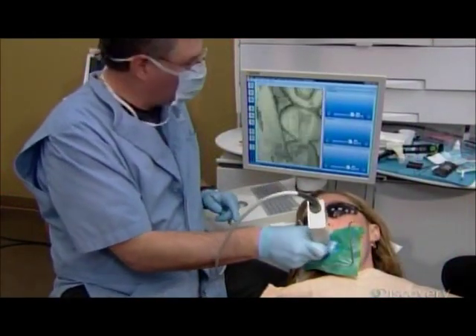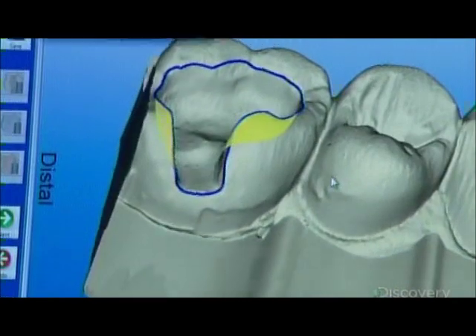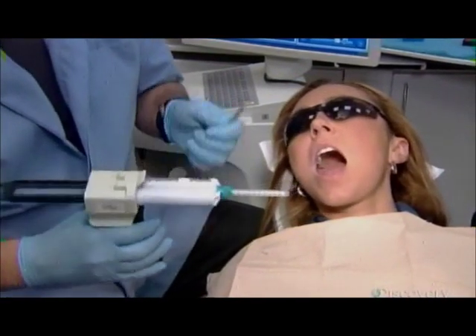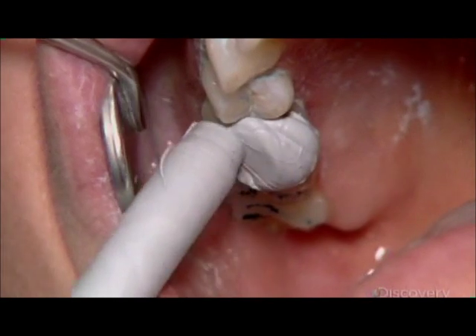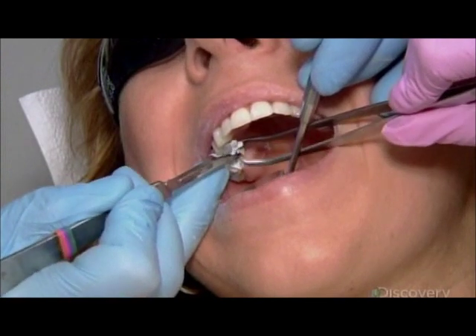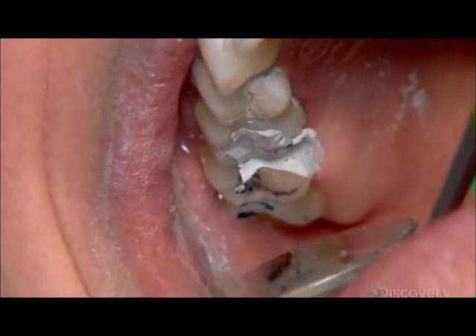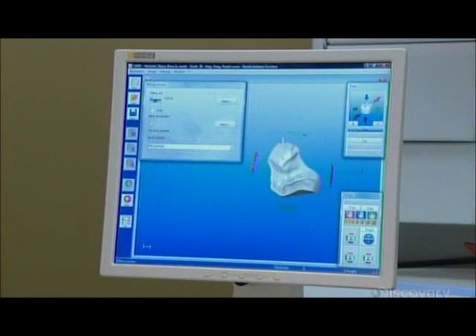The dentist activates the conditioner with a halogen light. He points a high-resolution LED camera at the tooth and downloads the image onto a computer, which converts it to 3D. Next, the dentist fills the cavity with silicone putty. When her teeth come together, they leave an impression in the putty that indicates her bite profile. Once the putty hardens, the dentist and his assistant chip off the excess. He downloads the image of the bite impression and then superimposes the images as he designs a custom dental inlay digitally.